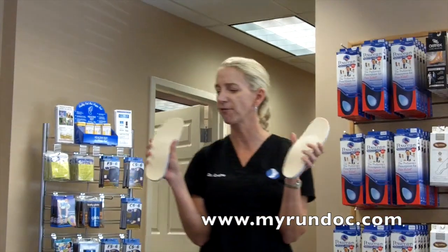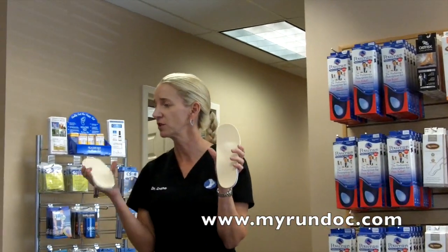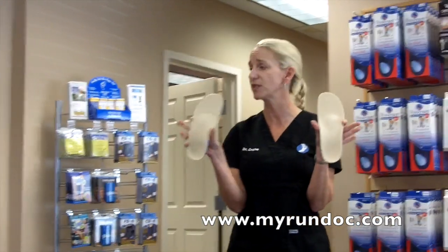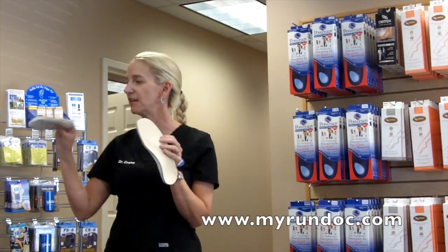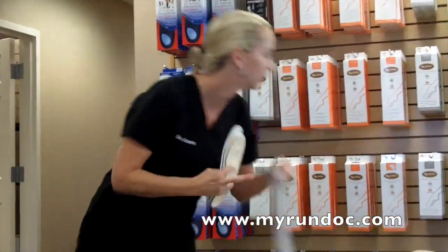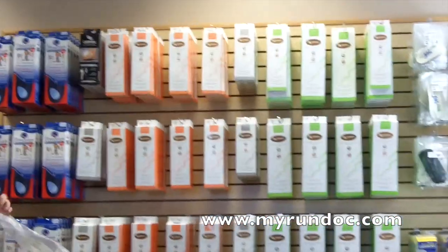A lot of my rheumatoid arthritics are in these, so that's a good option for that. It's also good for that frail little old lady who wants to go out walking. You put her in a ghost and give her one of these that she kind of conforms to, and she won't get as many blisters because a lot of elderly women in particular don't have a lot of fat pad on the bottom of their foot. This gives them that extra fat pad. I think orthotic-wise, that covers everything we have.